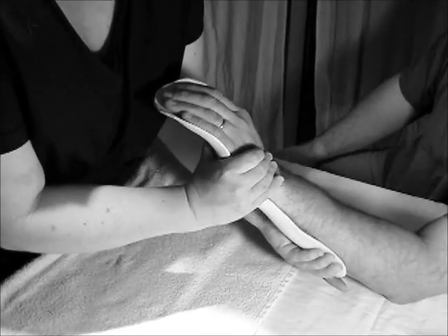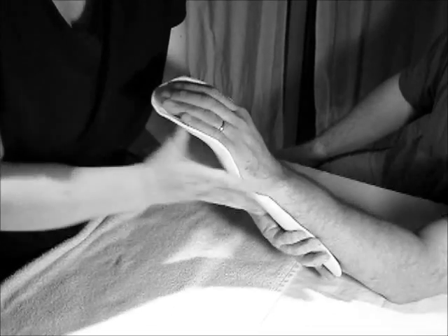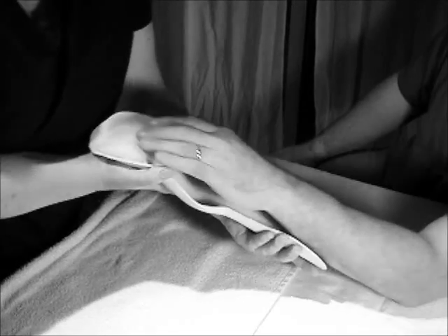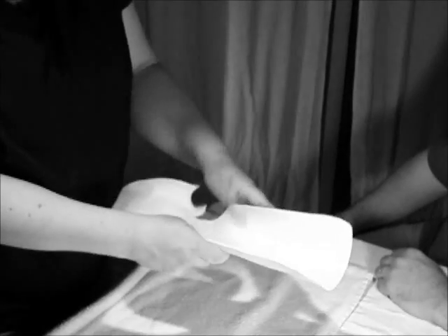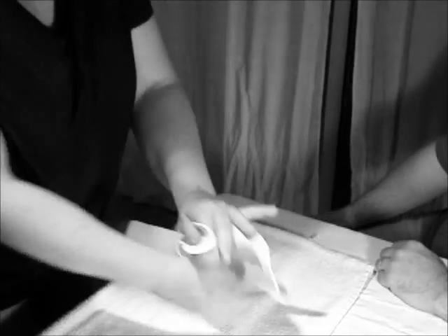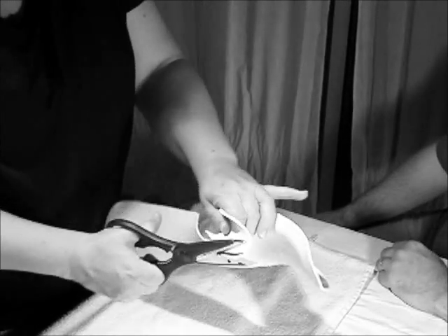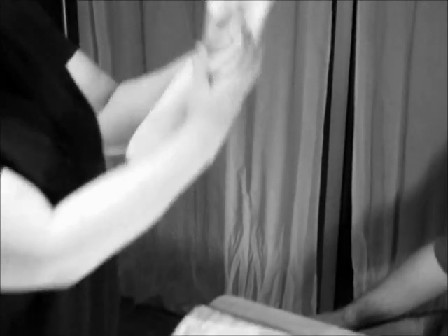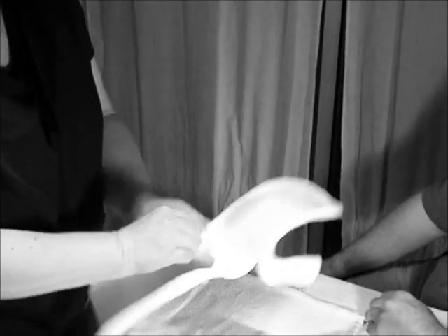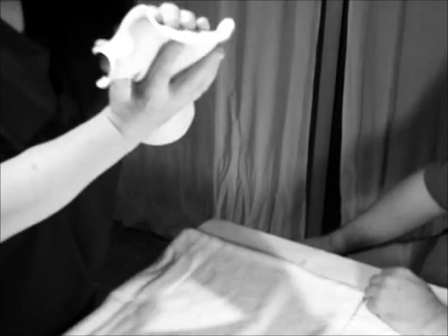So what I can do is either spray the cold spray on there, and you can go ahead and come on out. Or this is the completed splint. You can still work with it just a little bit and mold it. And while I have it, I know that thumb was way too long, so it's still nice and easy to trim up. And we can trim off the thumb right there. You can also bring the wrist back just a little bit, so it's still very moldable at this stage.